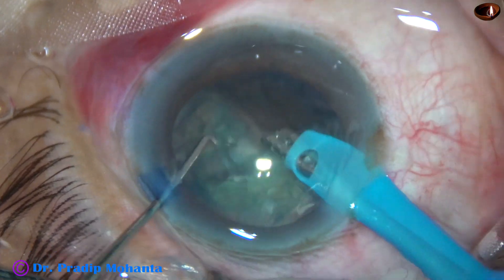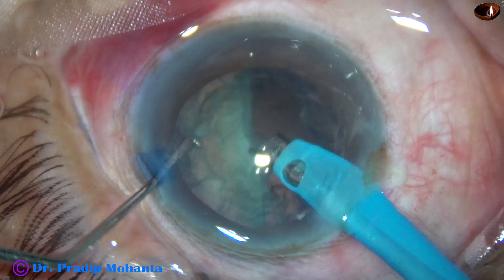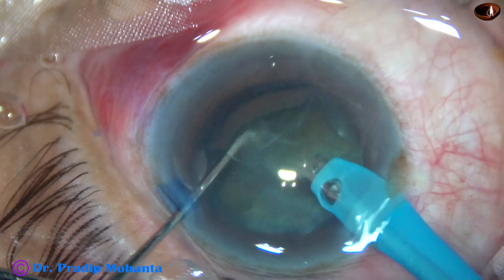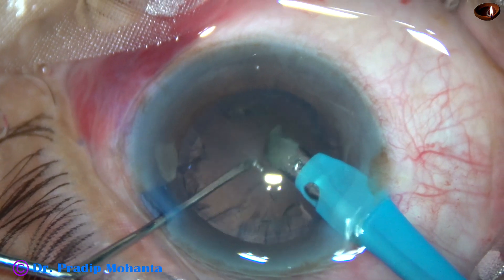Since this is a soft cataract, whatever piece is free is emulsified at that time itself. The ultrasonic energy is 60%, flow rate is 45 ml per minute, and vacuum is 450 mmHg in this case.